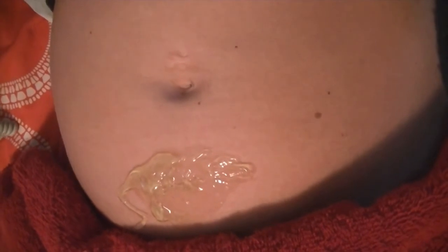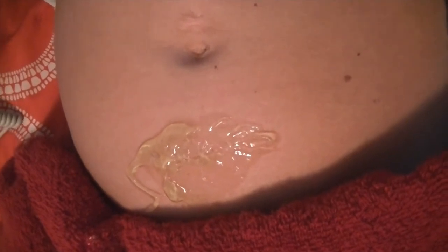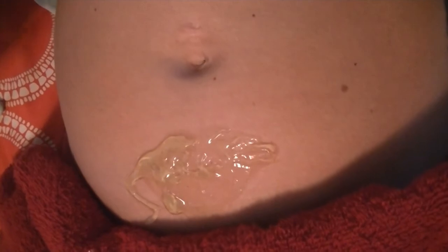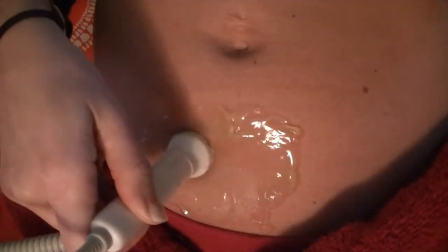So you'll hear a couple different noises. One of them is my heartbeat, one of them is the sound of the placenta, and the final is actually the baby's heartbeat. So, sorry about all this noise, but hopefully you guys can hear this. That's the baby's heartbeat right here. I'm 18 weeks and that's where I'm hearing it.